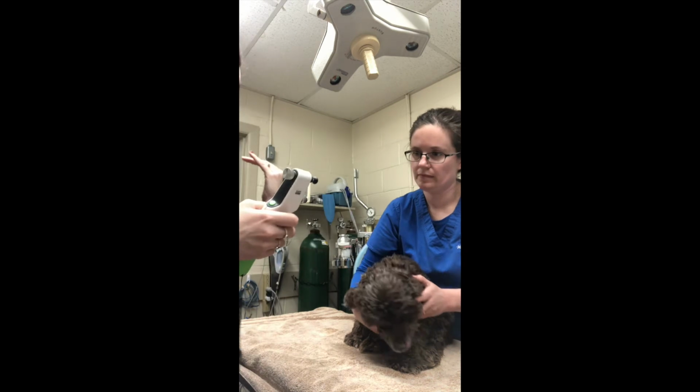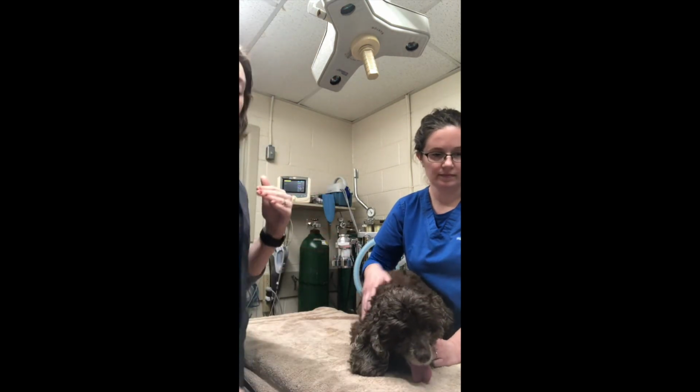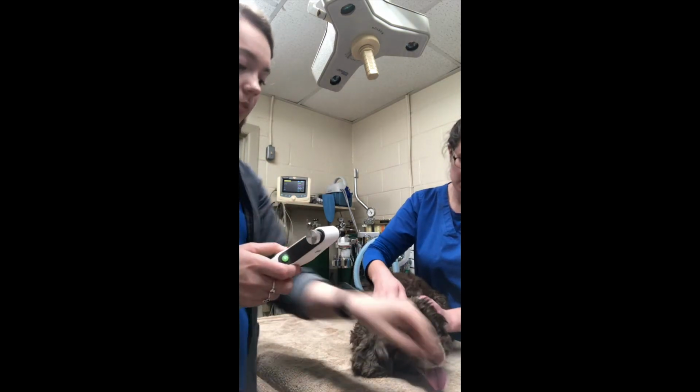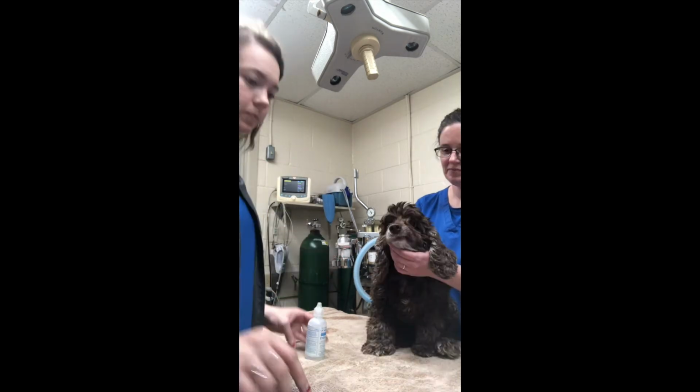And the left eye was about 20. So anything between 10 and 20 is going to be normal. Anything lower than that is going to be typically caused by inflammation, and anything higher can indicate glaucoma.